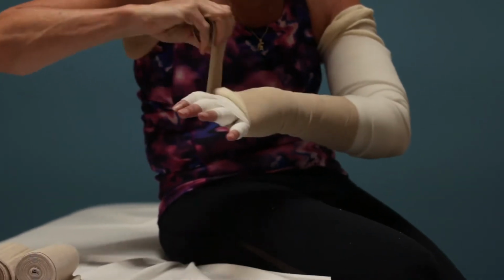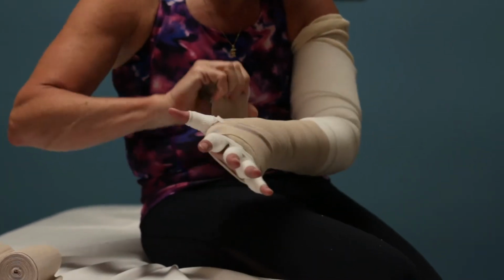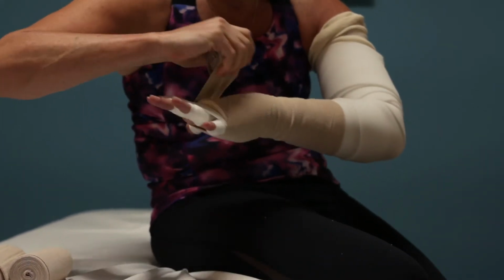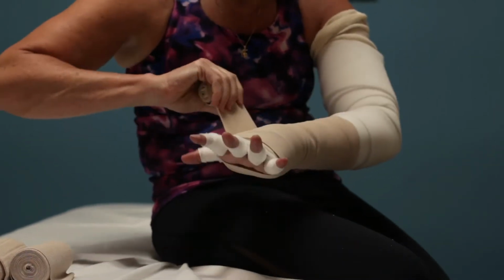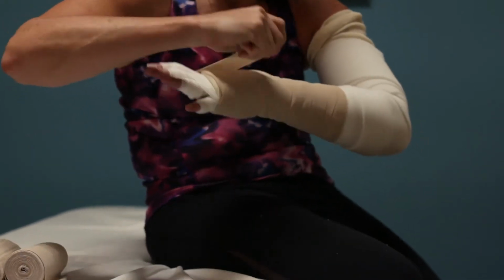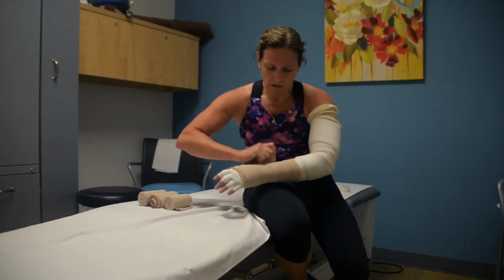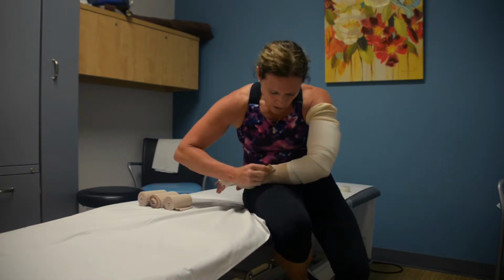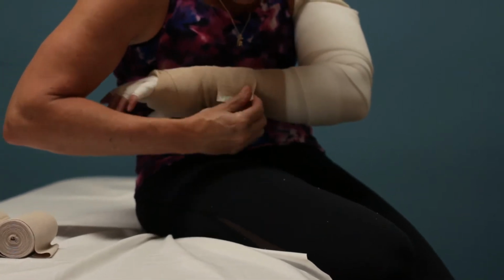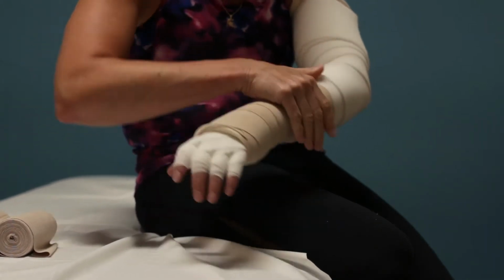So that's our first layer. Keep your hands splayed apart. And it's one layer right on top of the other. So this is our second layer of short stretch bandage, and this is our third layer. Just a little bit of pull on this. So that's 3 layers, and what we have left over, just start spiraling up till you run out, and you're going to take that edge and you're just going to tuck it right into itself. You can tape it. Sometimes, depending on where it falls, sometimes I'll tape it too. So that's your first bandage.